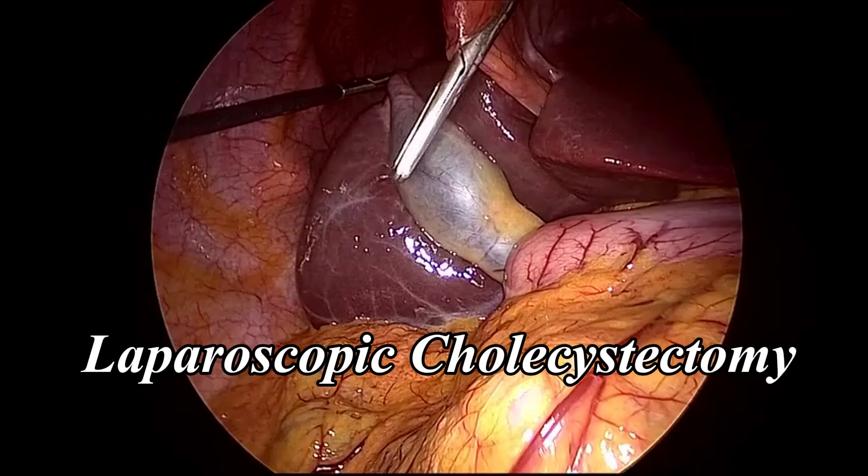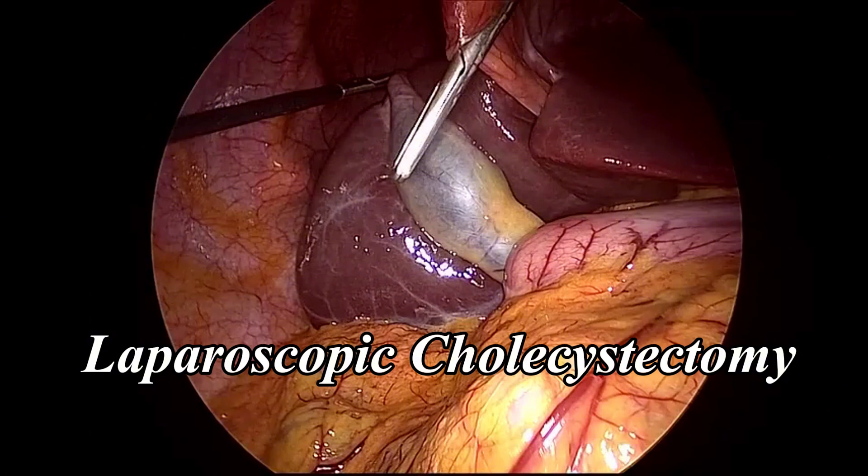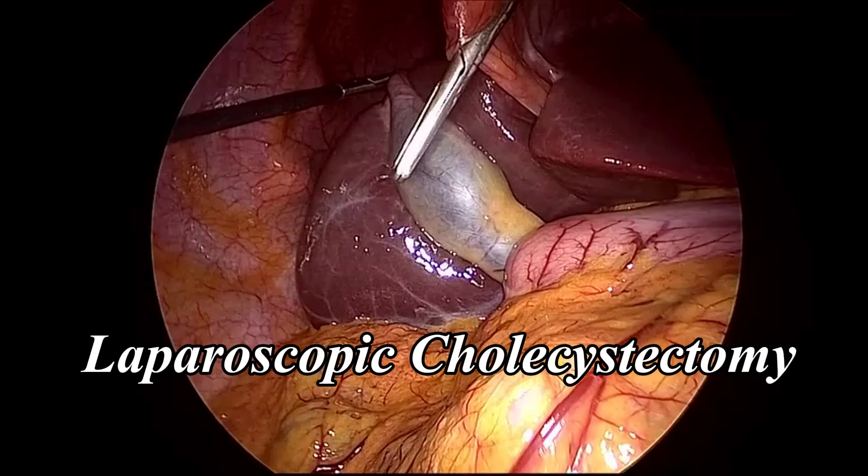Step 2: Access and Port Placement. Pneumoperitoneum is established using a Veress needle or open Hasson technique, typically through the infraumbilical incision. Once insufflation reaches 12–15 mmHg, a 10–12 mm camera port is placed at the umbilicus for a 30-degree laparoscope.